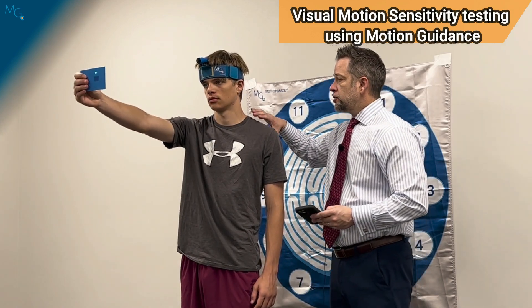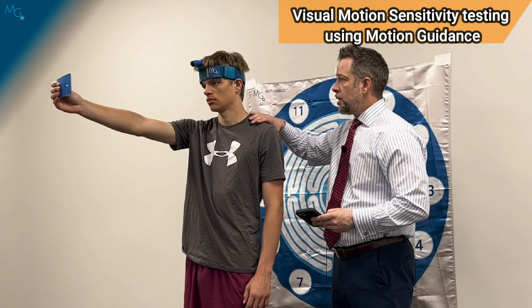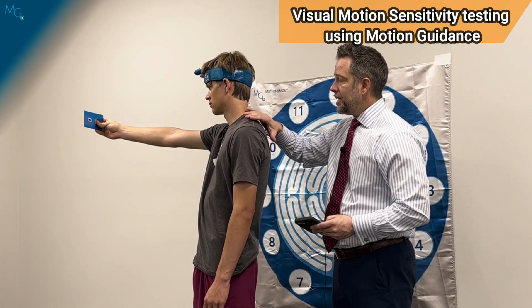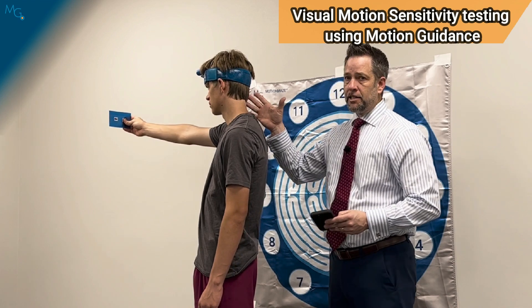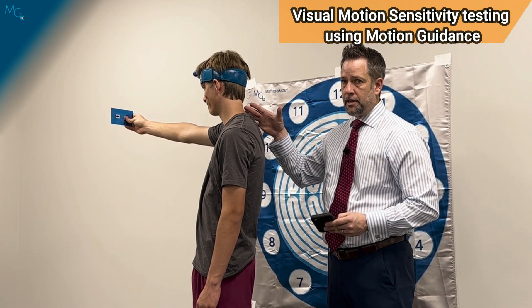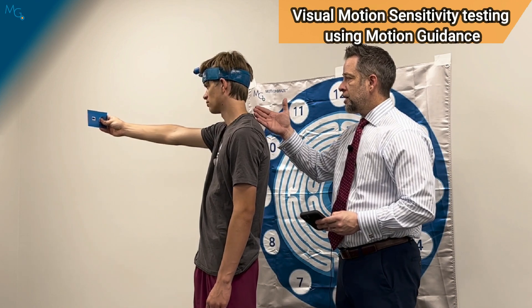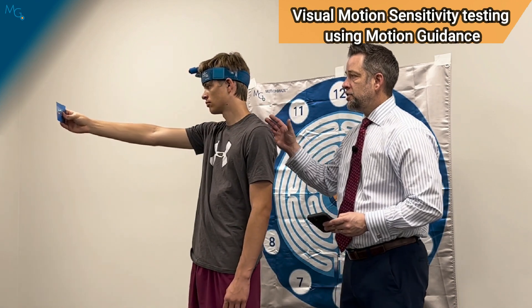If the laser comes off the card, this could give you insight into how the patient is moving. In this case, as he starts to move his body all the way to the right, if the laser then comes off the card but he continues to move, his head is now lagging behind during the VMS test. If he's able to acquire the laser and come back onto the card, and then as he goes left, the same thing occurs.